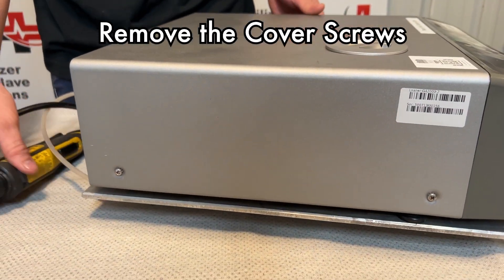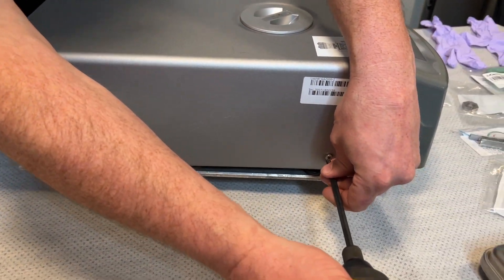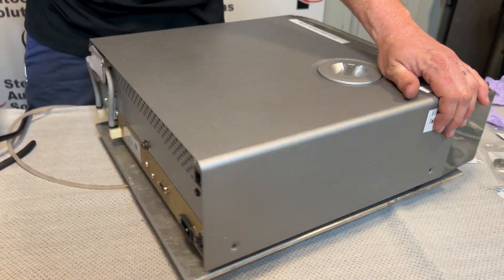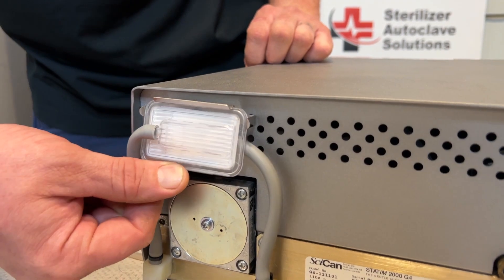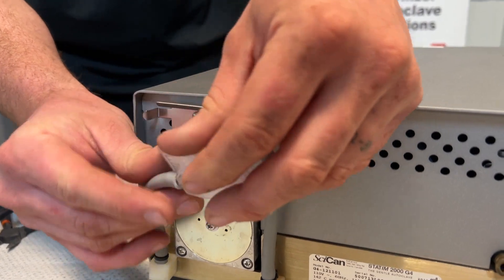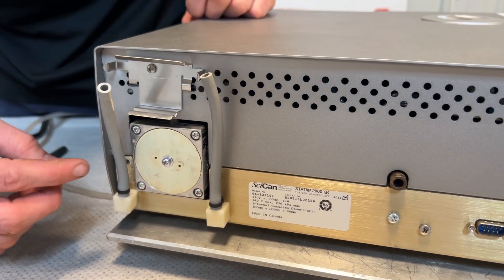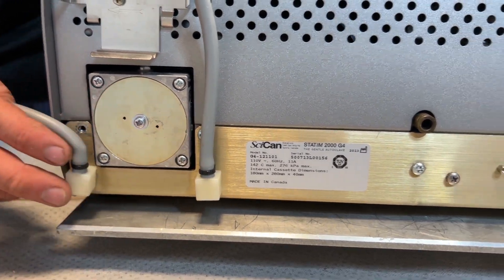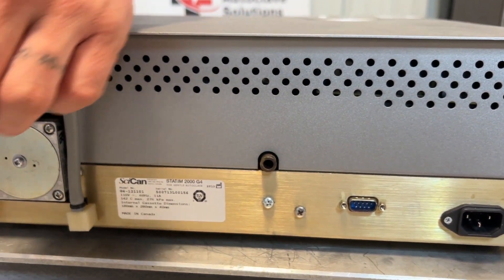There are seven screws that hold this top cover on — two on either side and three on the back. These should all be Phillips head screws. At the back you have a biofilter in a small bracket; push down on the bracket and the biofilter should pop out. We are going to replace this biofilter as part of this PM, so set that off to the side. The three screws to worry about are one on either side of the compressor and one above the power switch. The Phillips head screws in the middle you do not need to worry about.